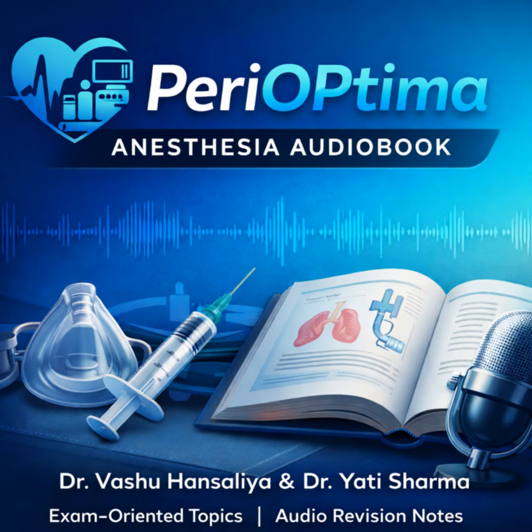And finally, just to bring it full circle, let's quickly reiterate that historical lesson on airway safety. Right. Patient safety extends beyond the machine. The sources remind us of Hewitt's development of the airway restorer, a simple oral device. And that just underscores the point. It underscores that managing the fundamental issue of airway obstruction, the tongue falling back, for instance, with simple physical adjuncts, is just as critical to patient safety as the most advanced electronic system in the world.